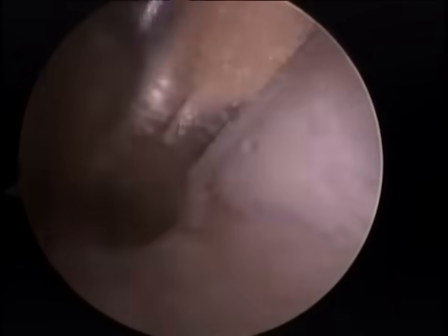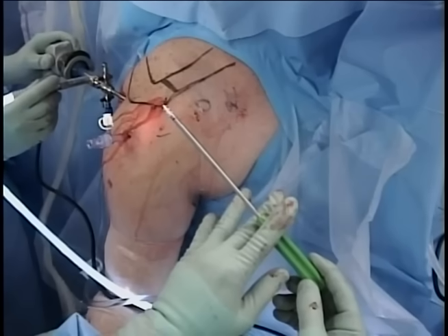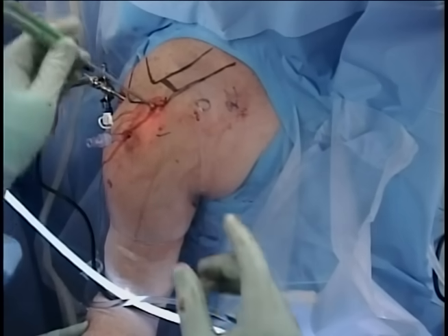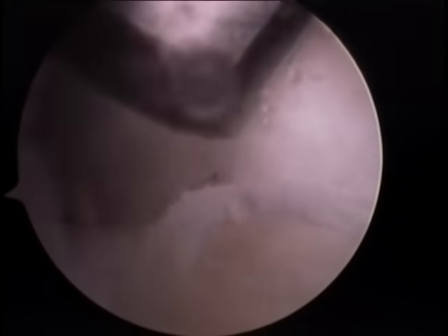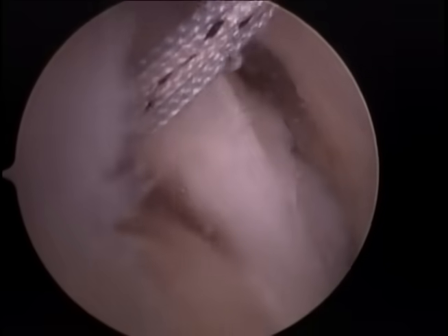Once the tap is seated, we can remove the tap, knowing our bone is prepared, and we are ready to place our bioabsorbable anchor, which you see here. We place this at the same angle of approach into our prepared pilot hole. We seat the anchor at the black line again, and then we pull on these sutures to assure the anchor is well seated in the bone.